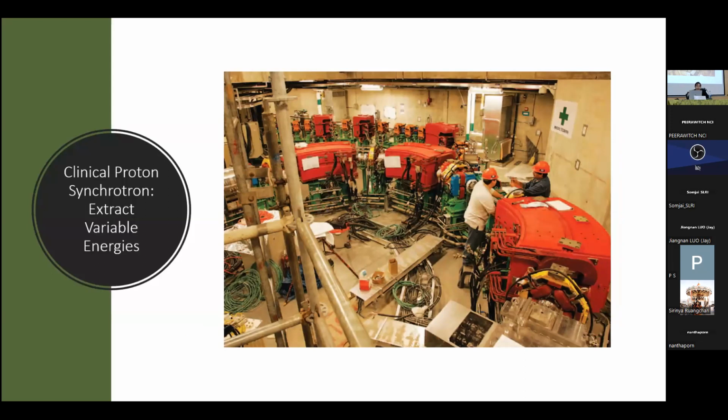Again, here's back to the synchrotron system. So for clinical proton synchrotrons, the key thing is you're able to extract variable energies. This is during the installation process. So the synchrotron has some advantages over the cyclotron. One disadvantage is that physically it's bigger.